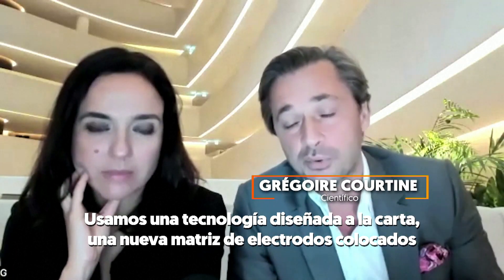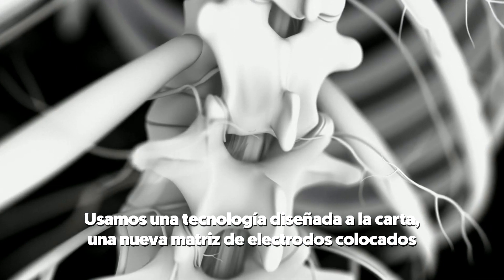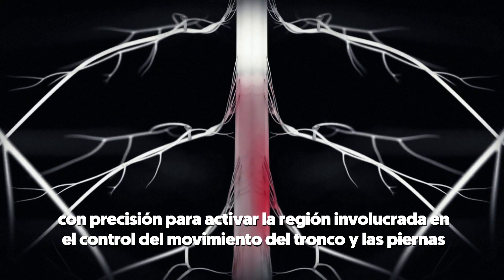In this study we describe purpose-built technology — a new electrode array with electrodes precisely positioned in order to activate the entire region of the spinal cord involving the control of trunk and leg movement.